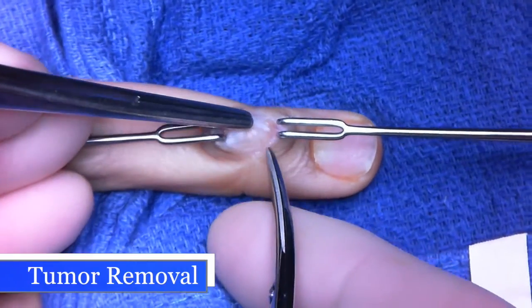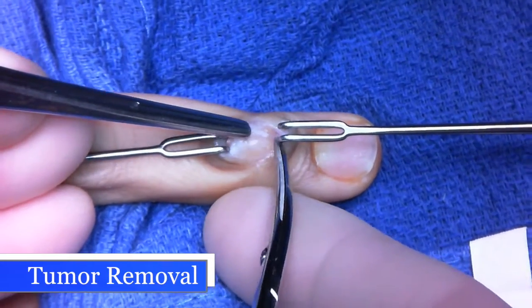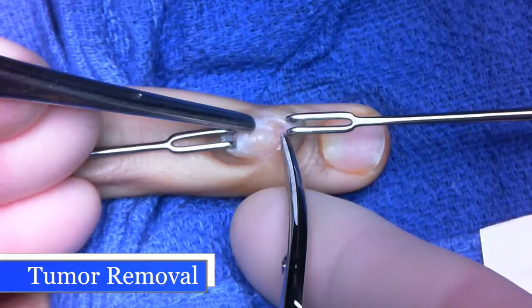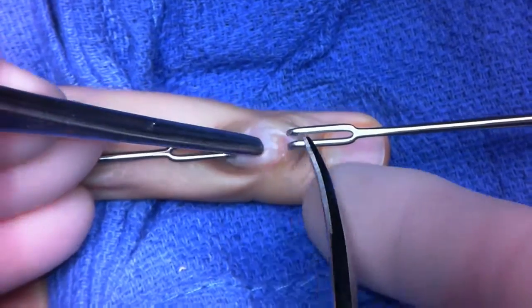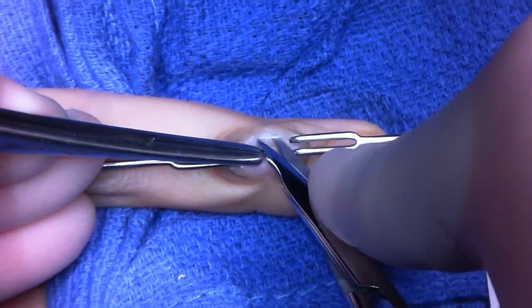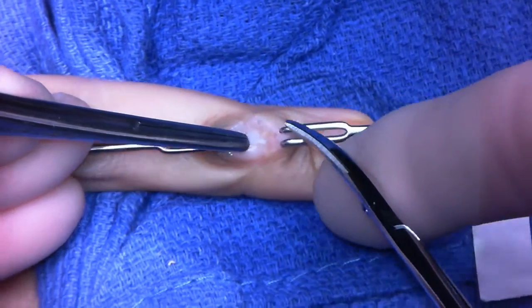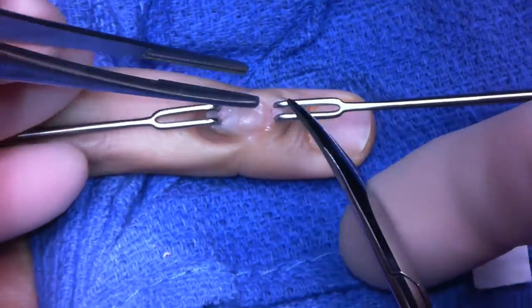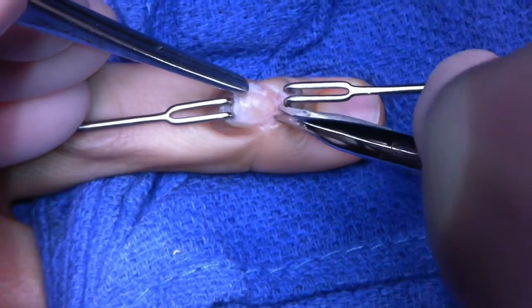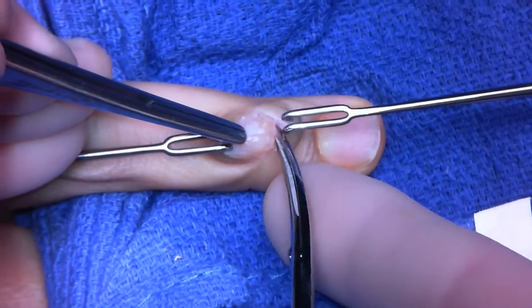Using scissors, I'm carefully dissecting around the margins of the tumor. The consistency, visually, is that of a Giant Cell Tumor.